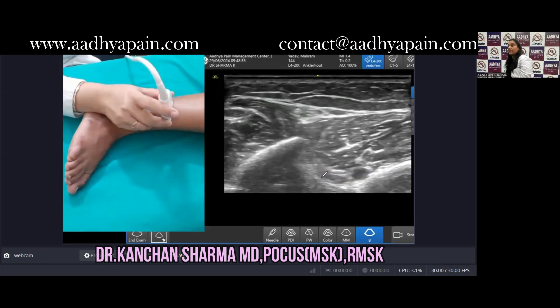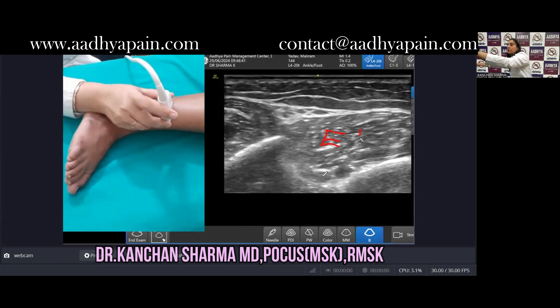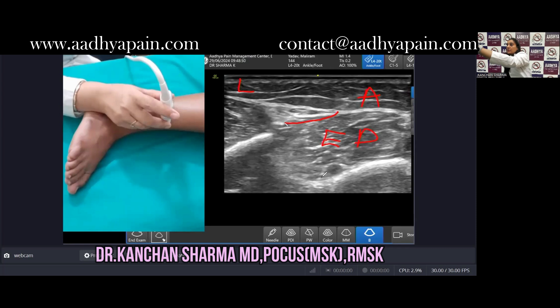Once you move the probe like this, you will be able to see the extensor digitorum muscle. This is a muscle of your anterior compartment, and this is your lateral compartment. Now in between these two compartments, you will be able to see the superficial peroneal nerve.